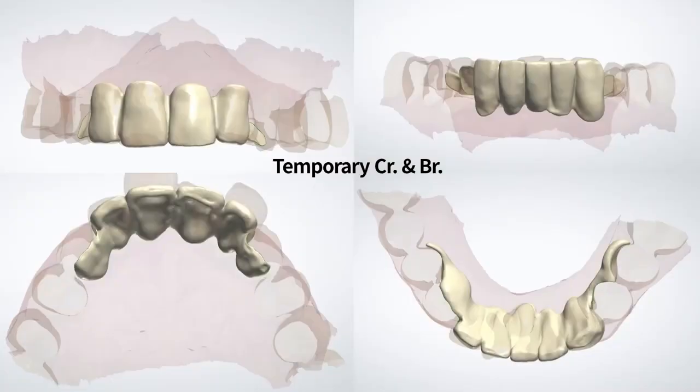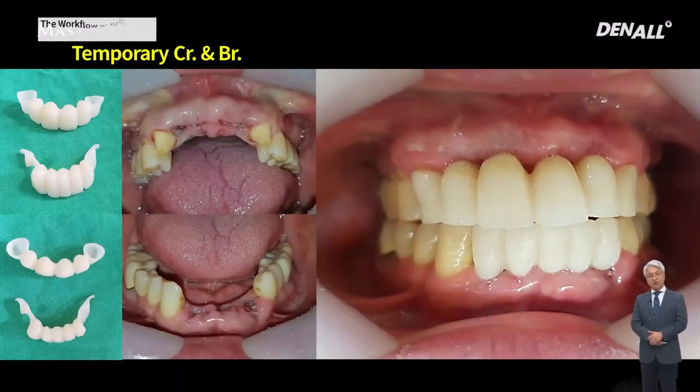Clinically at our dental clinic, I use most frequently the 3D printer for bridge type provisional or Maryland type provisional and a removable provisional along with surgical guides. 3D printer is more economic compared with milling machine, and it is more extensive in terms of applicability. In most cases, rather than milling machine, 3D printer is used. The fabricated provisional is delivered to the patient.